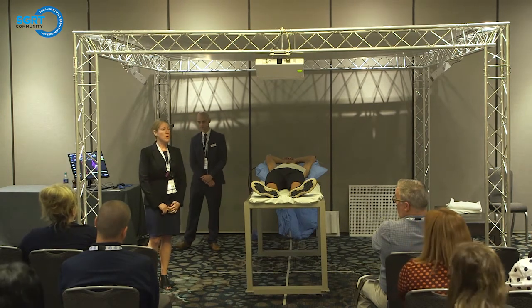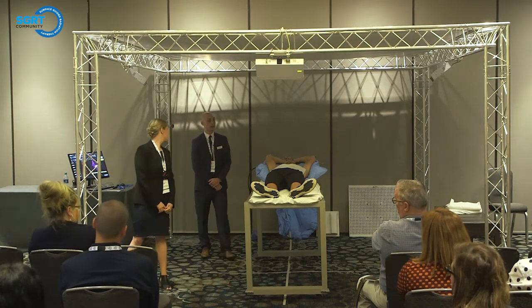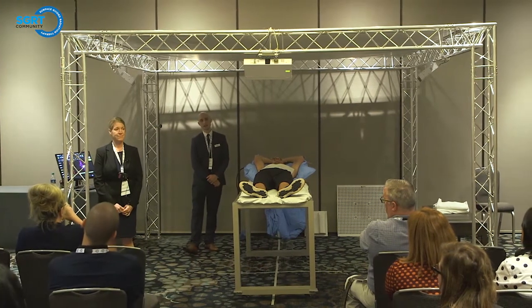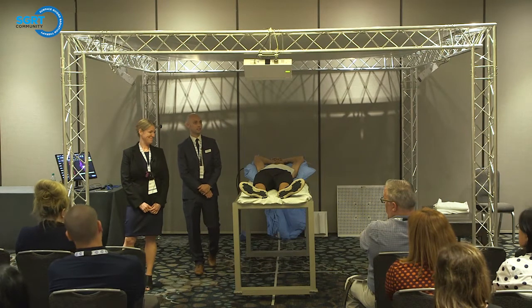But the bolus field's in record mode. That's a good question. We'll have some time afterwards to go over that as well. So any questions you have afterwards, we can go over how to set up those fields for sure.